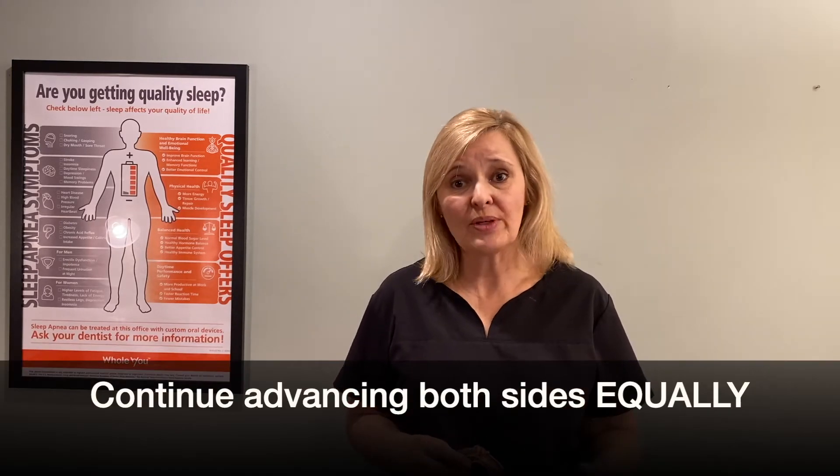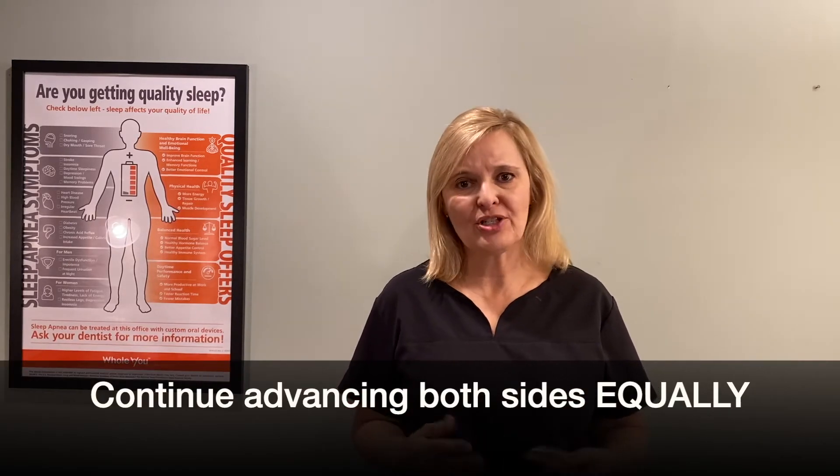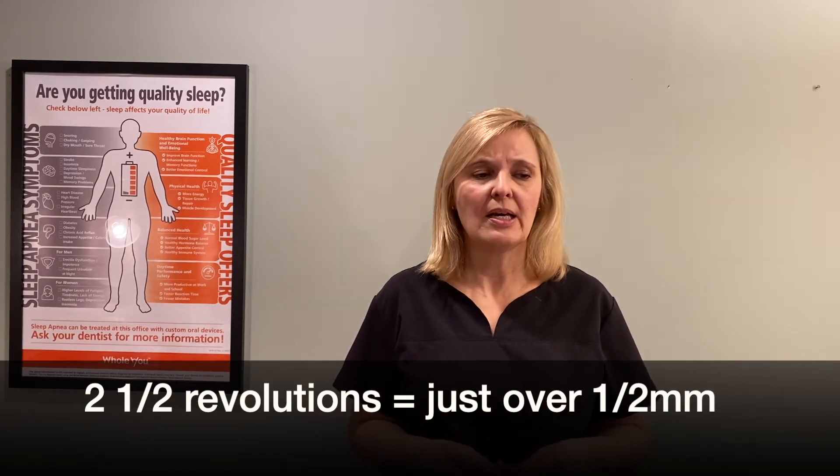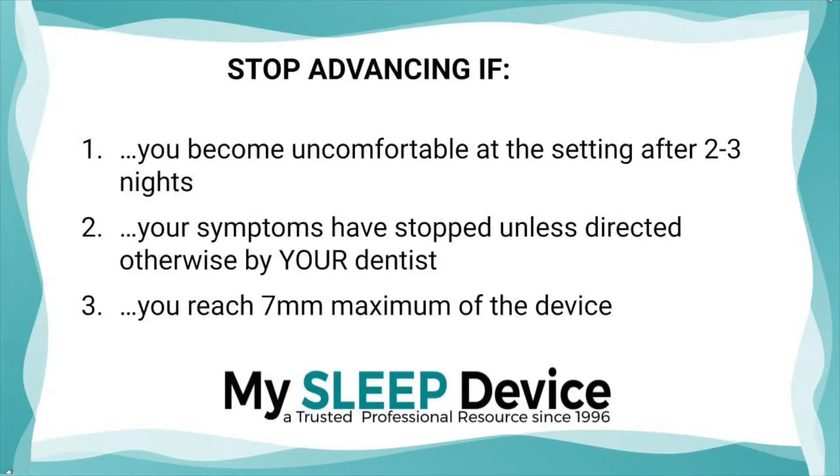That's what you would repeat about twice a week or weekly. For my patients, about every three to four nights they can turn it about two and a half full revolutions. But again, talk to your provider. When to stop advancing: you definitely want to stop when you have any discomfort that doesn't get better, especially if you've tried two to three nights at that same setting. It's normal to have a little discomfort when you first advance it, but by the second or third night it should be comfortable. If not, don't keep going further and you might even want to rewind it a little bit.